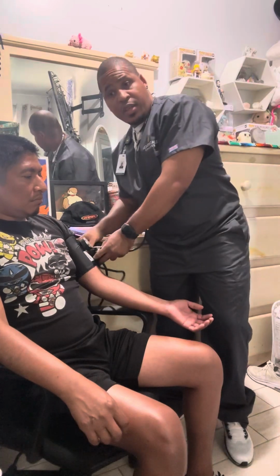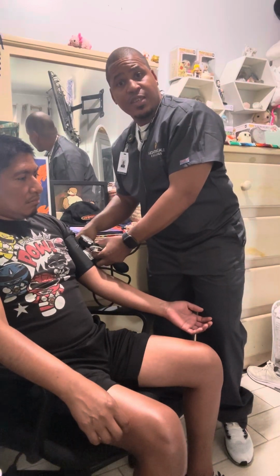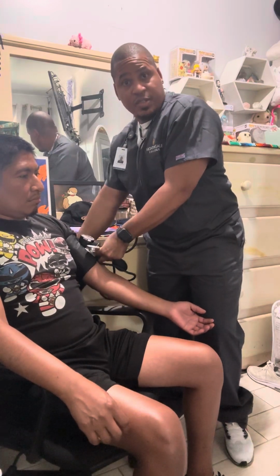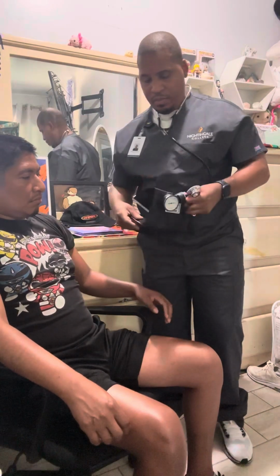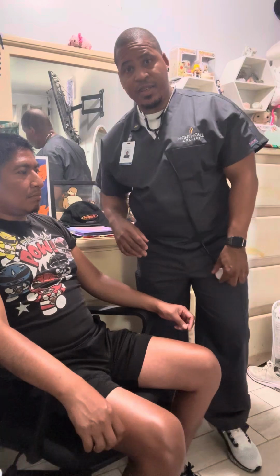So he has 120 over 70 as his blood pressure. Systolic is at 120. Diastolic is at 70. He's still considered to be in normal range. So that completes my assessment.